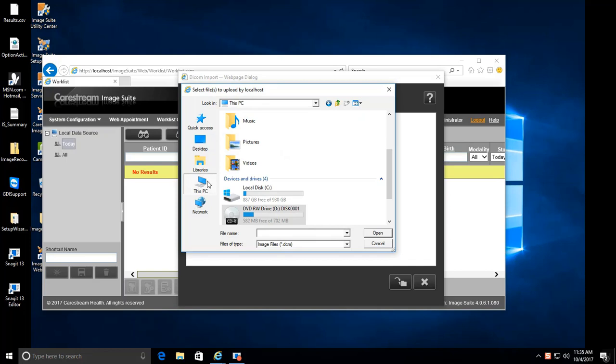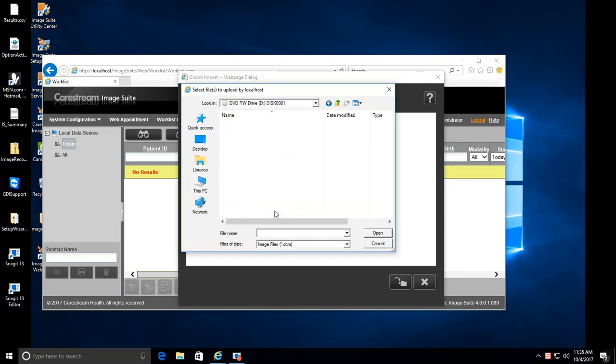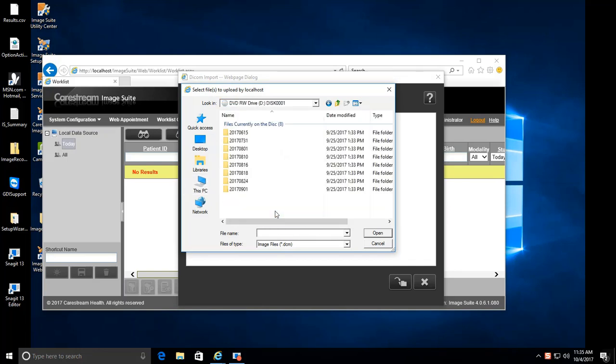On the left-hand side, click This PC button. Locate your DVD drive and double-click.